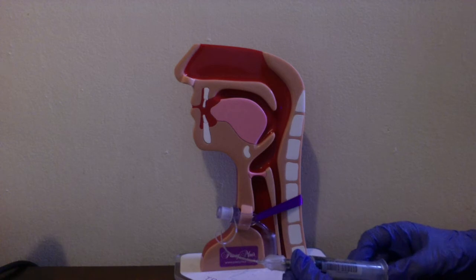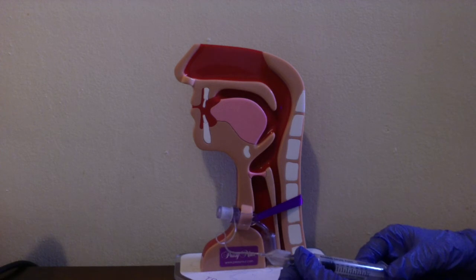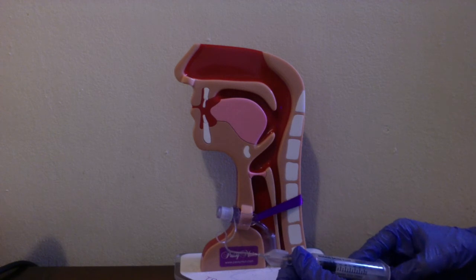So slowly deflate the cuff, taking maybe two cc's at a time, and then we might need to suction. Have the patient rest for a few seconds and slowly deflate the cuff until the cuff is fully deflated.